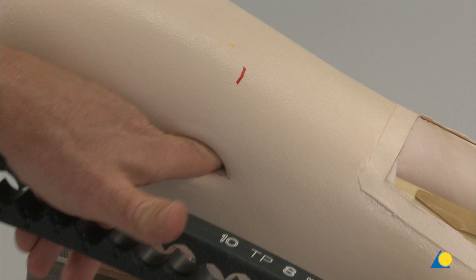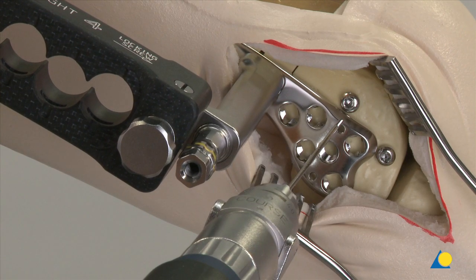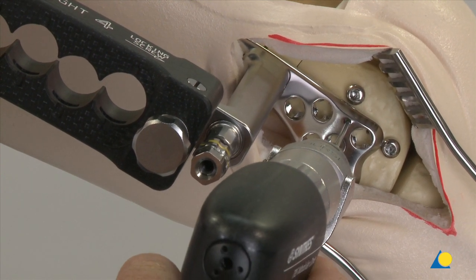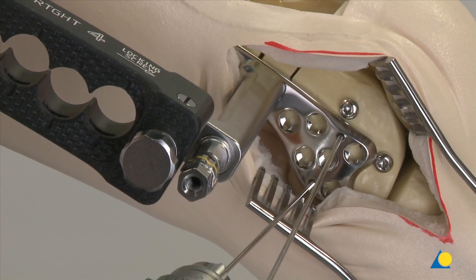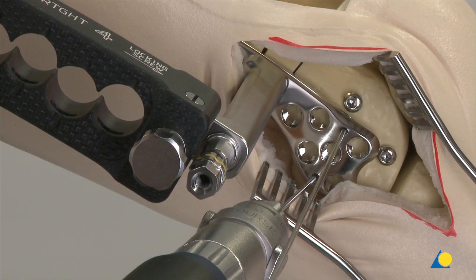The position must be checked under image intensification. The plate is temporarily fixed distally using 2 K-wires through the K-wire holes in the plate head. At this stage, the fracture must be fully reduced, as the correct plate position is dependent on the correct length, alignment, and rotation of the fracture having already been achieved.